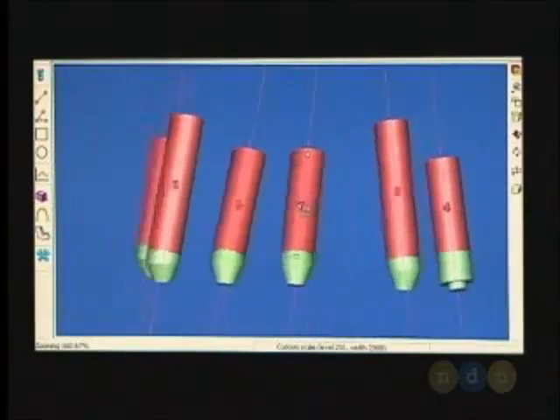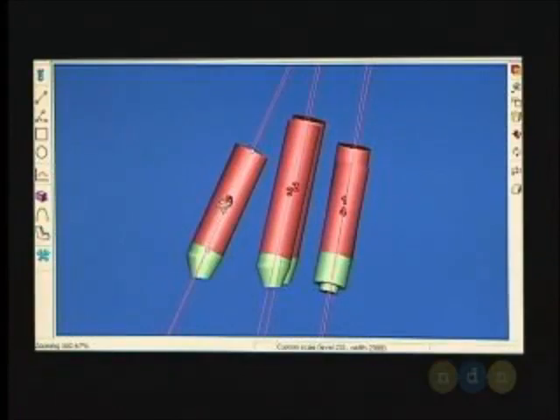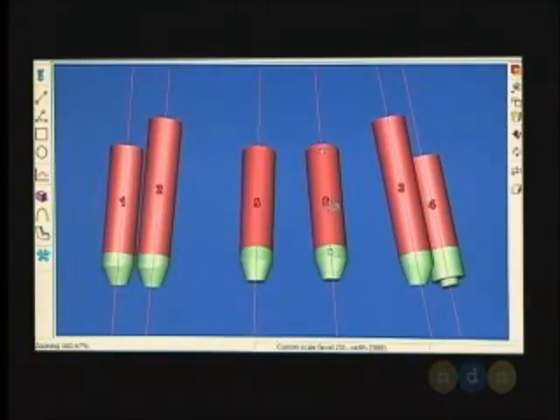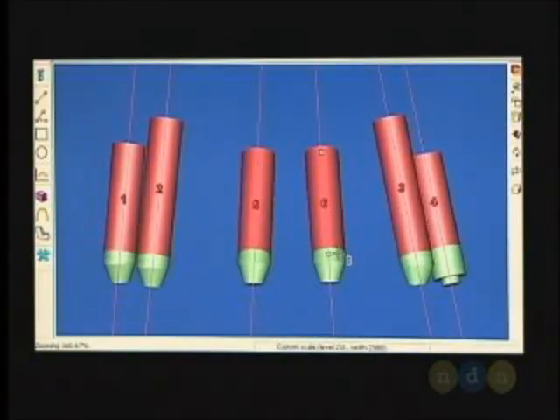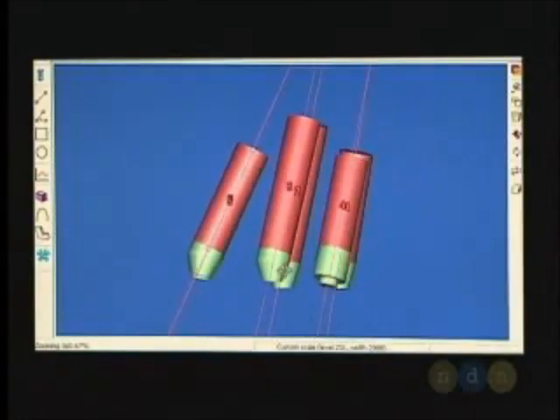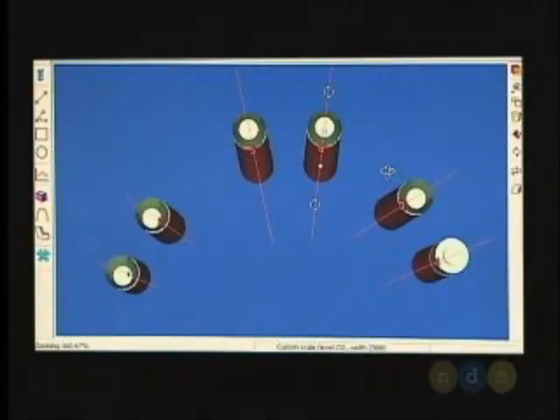And you can see as I turn this around in 3 dimensions how everything can be lined up exactly well on the model and then taken into the mouth. And we're going to show you how we can do this. Look at this technology, which really enables us to plan. These green pieces are the abutments and the red is the implants. So basically it gives us very, very precise rendering of the screw axes, the angulations, and of course our ability to correct those angulations.